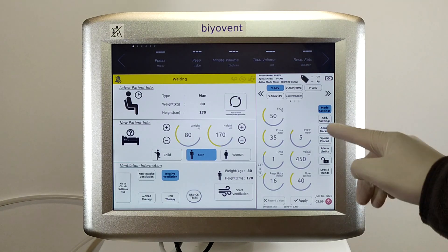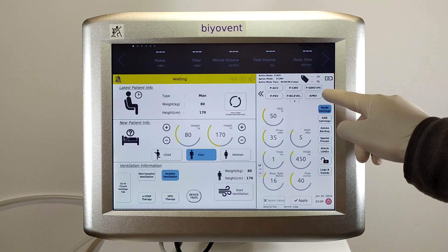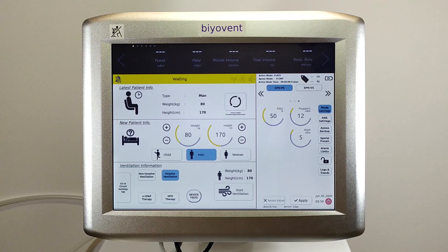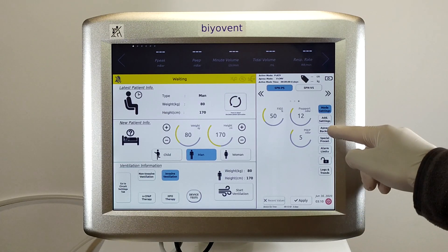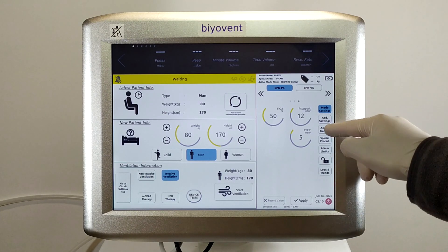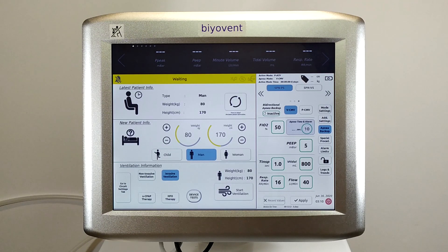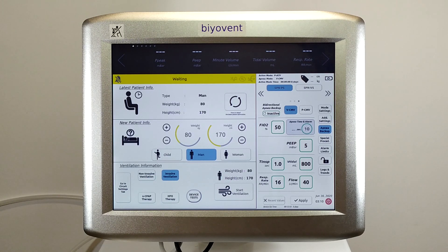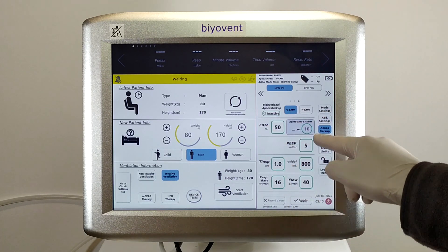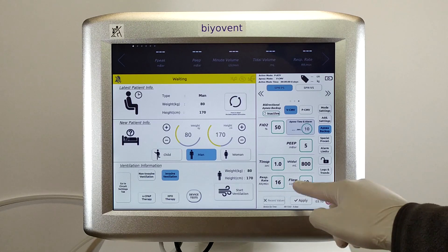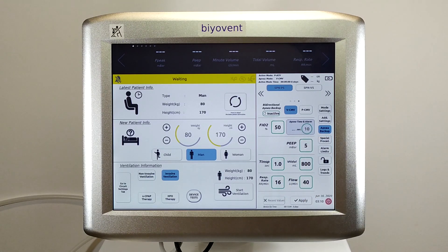Apnea support mode works only in spontaneous modes. You can open the settings by pressing the apnea backup button. If you are going to use spontaneous modes, you should definitely configure the apnea mode settings before starting ventilation. Otherwise, BioVent will use default settings.